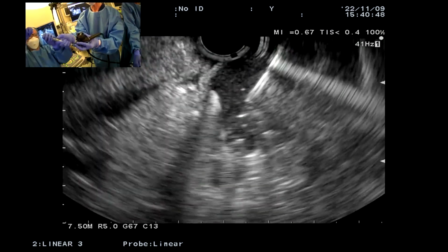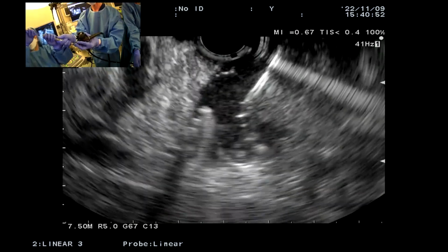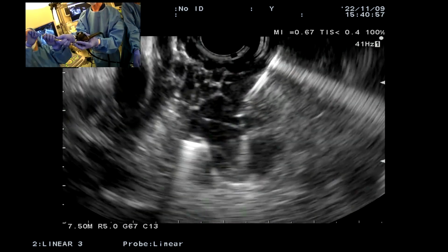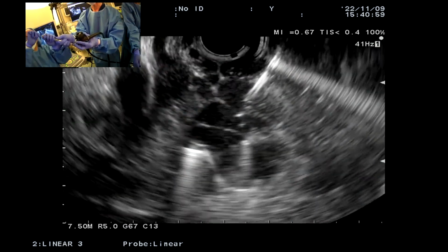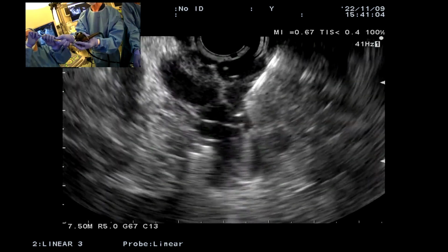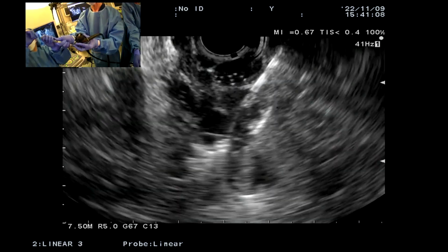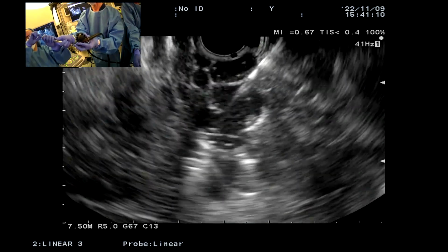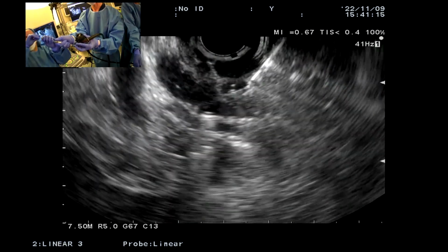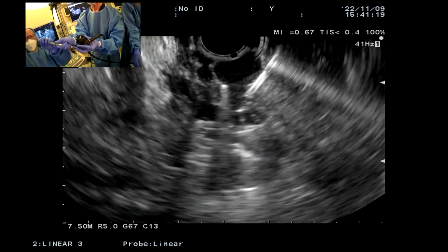So as we deploy this next one, I'm going to pull back my needle a little bit just so that I could get that coil to hopefully. Now, sometimes what I'll even do is have a little bit of that coil come outside the esophagus. But that's really, okay, go ahead, please. Okay, see, I'm pulling back a little bit just so I really get that coil now deployed more proximally and more towards the esophageal wall. All in? That's good. Now I think we're ready to inject the glue.